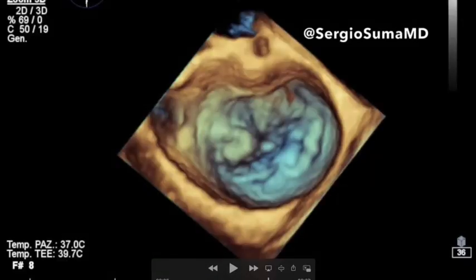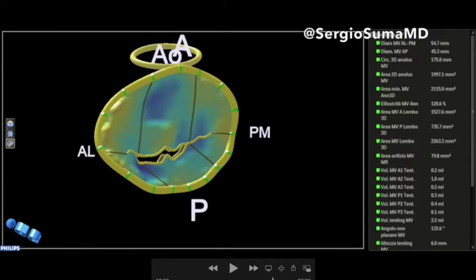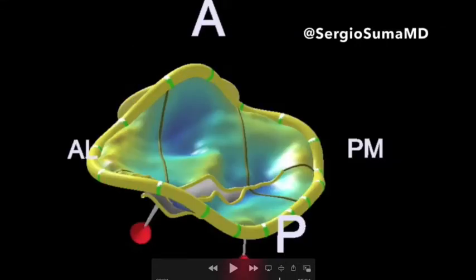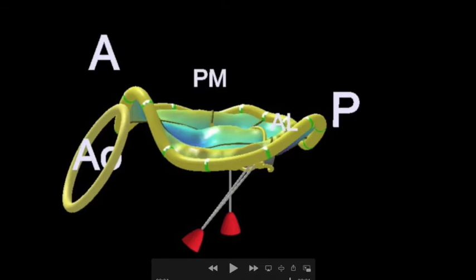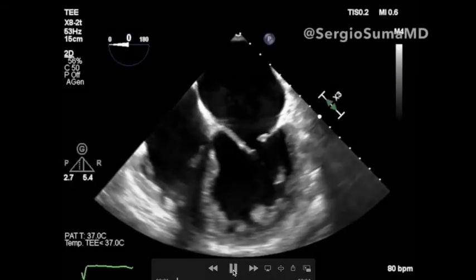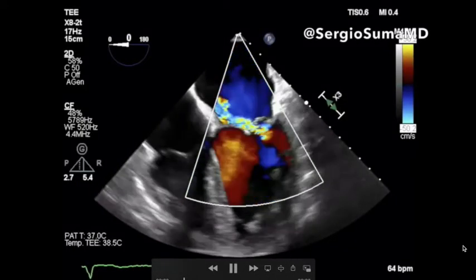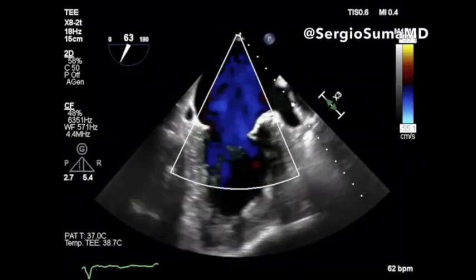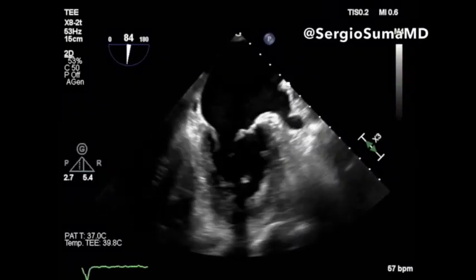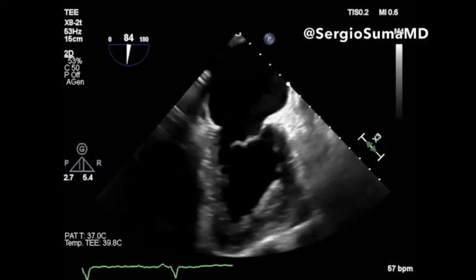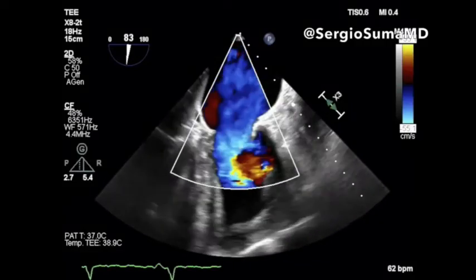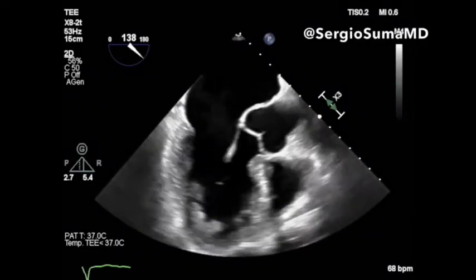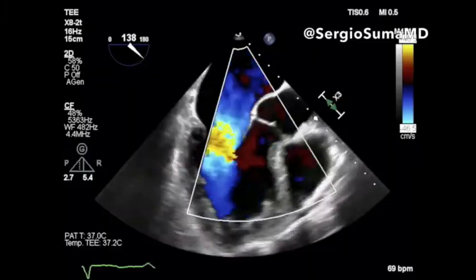This is confirmed at the reconstruction of the valve, with an annulus which is dilated as well. There is indeed severe mitral regurgitation due to the prolapse of the commissural part of the valve in the lateral commissural part.